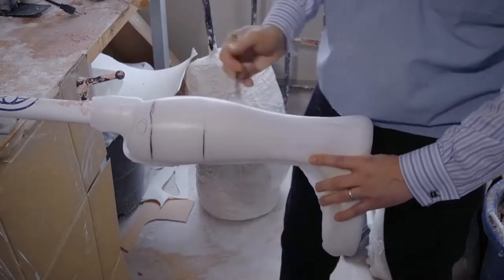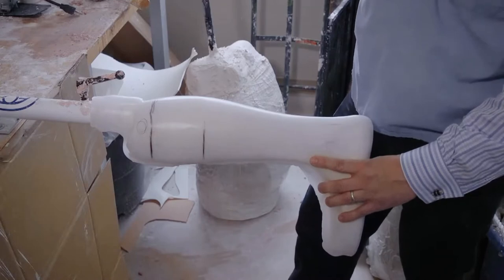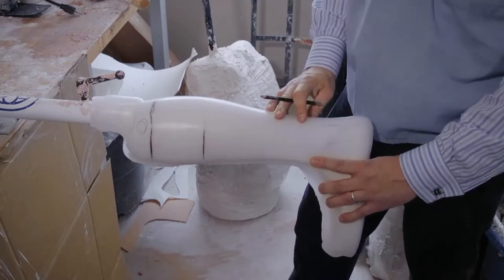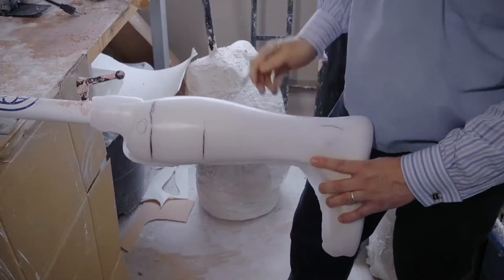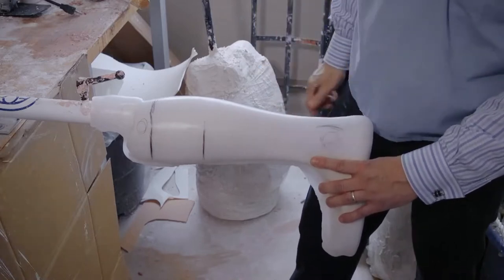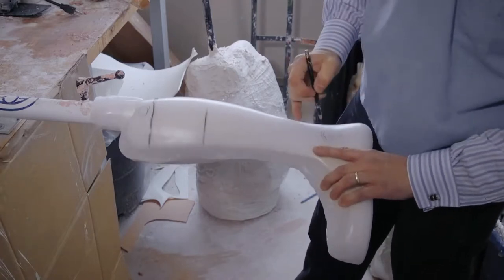We'll say this is the ankle, the apex of the ankle right there, and I want to create the brace called a flexible AFO. The brace itself is not necessarily flexible, but you could compare it to a solid ankle one, and in a relative sense, it would be more flexible. But when an orthotist or brace person talks about a flexible AFO for foot drop, this is what they do. They trim back behind the ankle bone, in this general vicinity right here. We're trimming behind that because we don't want to rub on a bone. That would not be fun for the patient or the orthotist. So this is what it turns out to be.